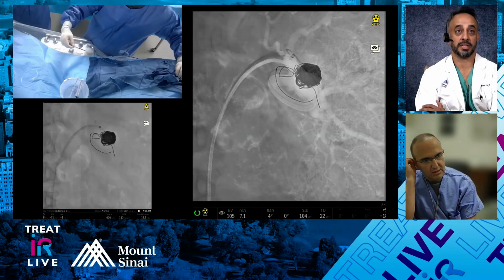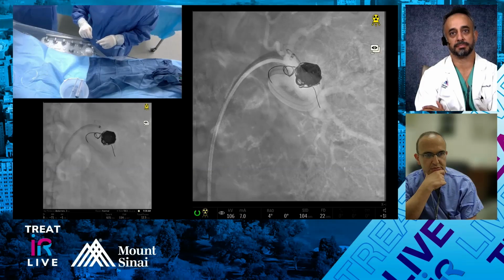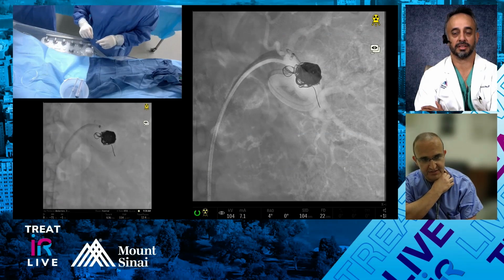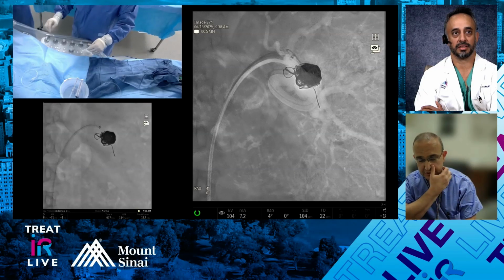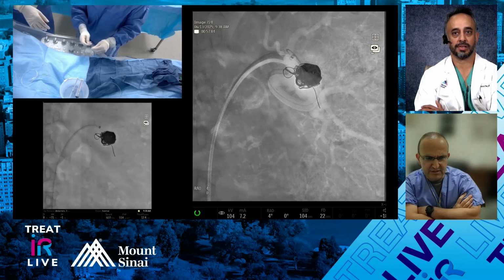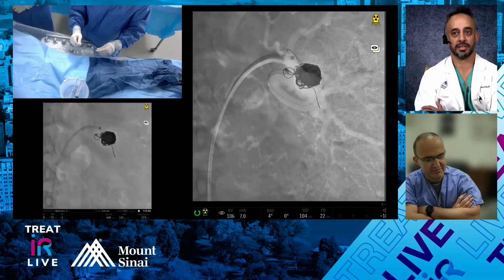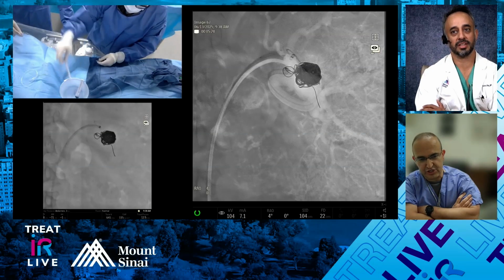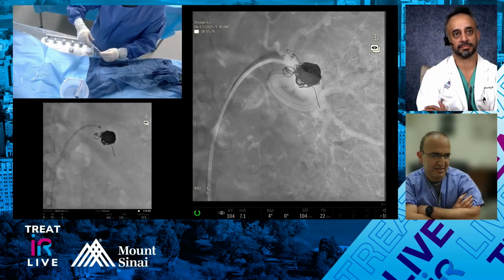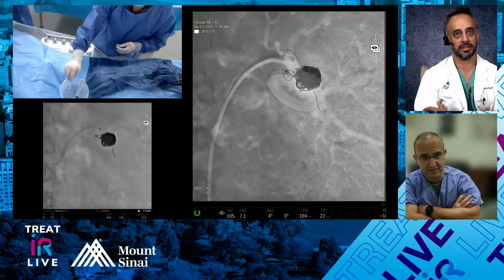Well, that one seems to be nice because it'll go through a glide cath, where the interlocks are a bit more catheter dependent. Yeah, I completely agree with you, Rahul. If I can get an 035 catheter in a big aneurysm, the volume of coils you need is exponentially bigger as you go up. I think Terumo still has those coils, and we have them here too. The name slips me, the Azores hydrogel coils. They're a little stiff, but because they expand, they have some advantage in big aneurysms. But yeah, if you can go with 3.5, definitely.